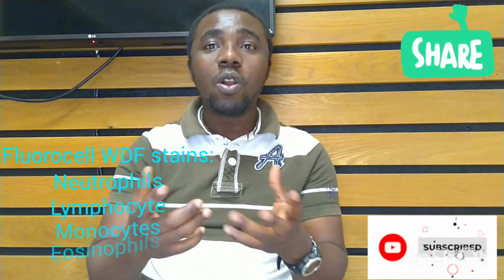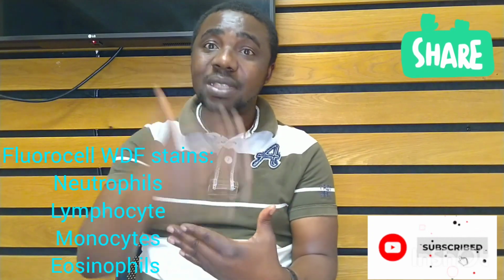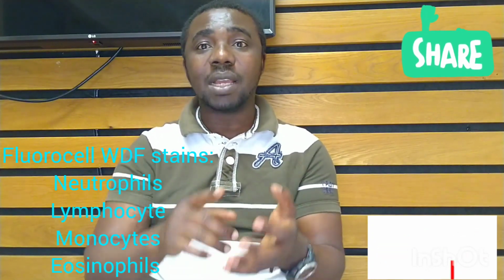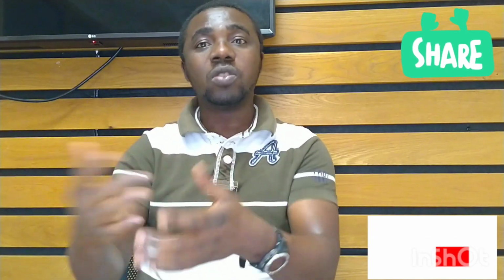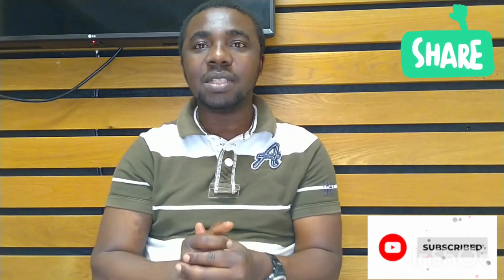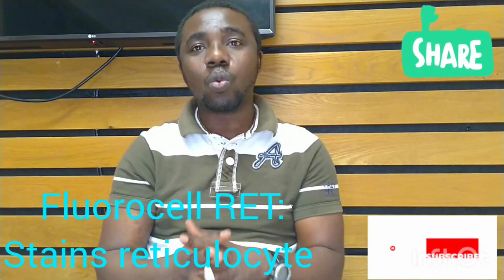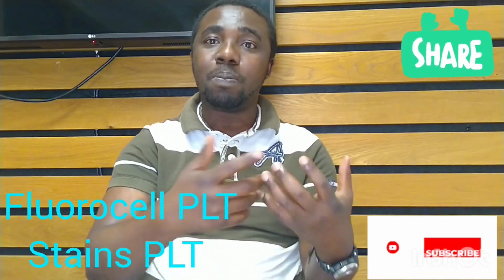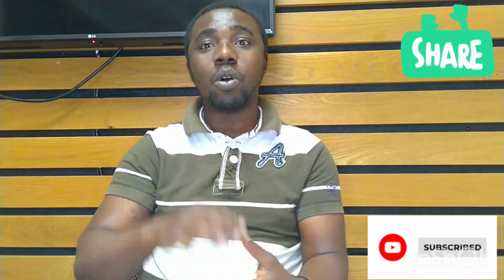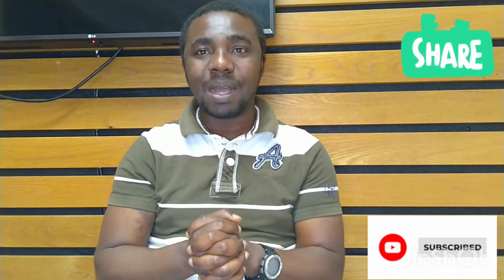Next one, you look at Fluorocell WDF. Once again, what the Fluorocell WDF is going to do is to stain differential cells like neutrophils, lymphocytes, monocytes, and eosinophils. It will stain them, and then that will also help to be quantified through fluorescent flow cytometry. Then you have Fluorocell Retic, that will again stain the reticulocytes, which will help to quantify the reticulocyte count of the patient. Then you have Fluorocell Platelet or Platelet-F, that will help, of course, to stain the platelets, and that will again help to quantify the amount of platelets.